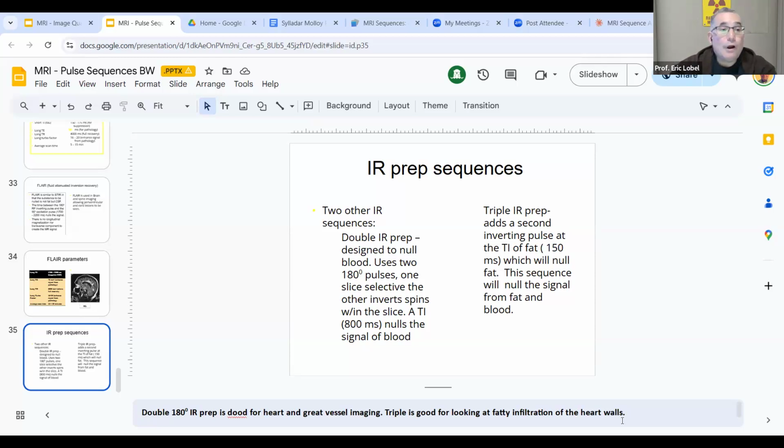All right, everyone. I will send you the PDF. I think it's called an interactive taxonomy of pulse sequences. However, it's no longer interactive, as I mentioned. That's really good.